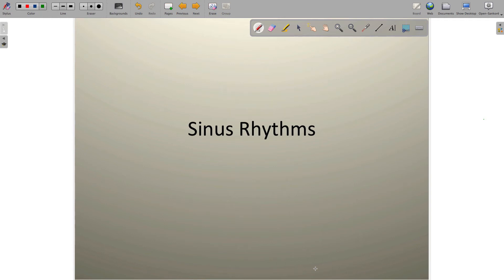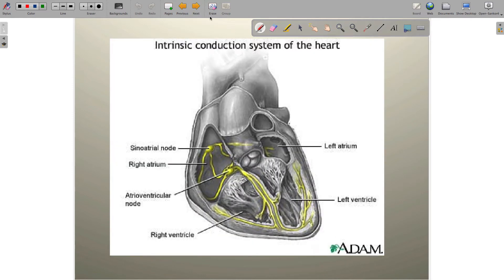Alright, welcome back everybody. Hopefully you're excited about getting into the EKG stuff, so let's delve right into it. In this video we're going to look at all of the different sinus rhythms — all of the things that originate in the SA node. Anything that originates in the SA node is said to be a sinus rhythm.